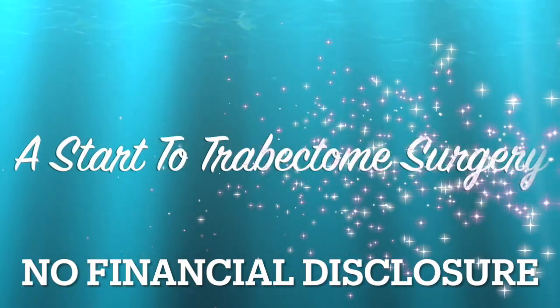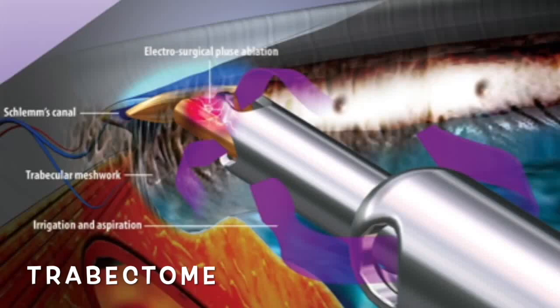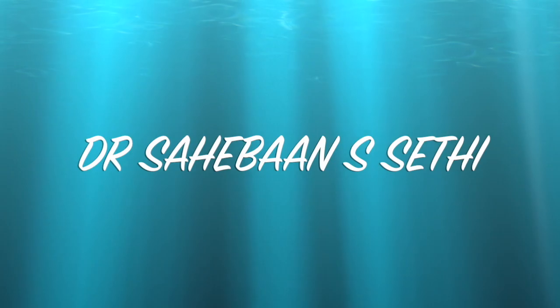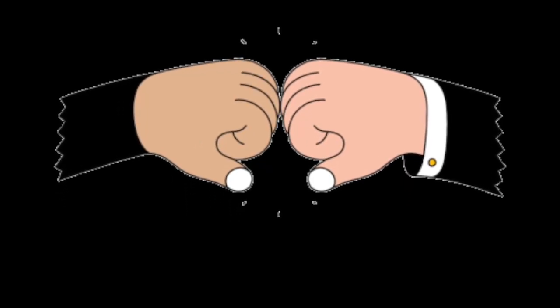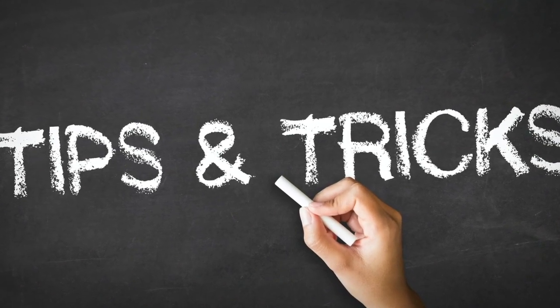First trabectome surgery, joining thousands of surgeons worldwide who are doing this elegant procedure. Hi, I am Dr. Sahebaan Sabharwal from India. As a beginner myself, I would like to share my tips and experiences to help and encourage young surgeons to take the plunge. In this short video, I am going to discuss a few top tricks that I wish I knew from the start and hope that it works for you too.